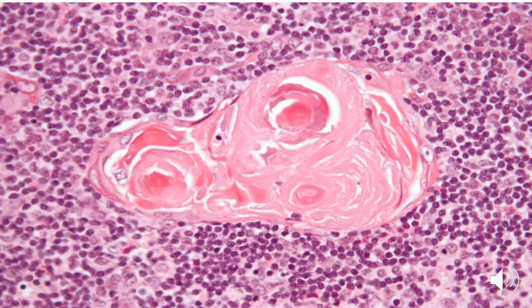This is a picture of one of the Hassel's corpuscles in the thymic medulla. It is actually composed of type 6 epithelial reticular cells that are arranged in concentric manner. This is another picture of a Hassel's corpuscle. If this will come out in your exam and you are asked to identify the organ, you should write down on your paper thymus. If you are asked to be specific with your answer, you write down medulla of the thymus or thymic medulla.